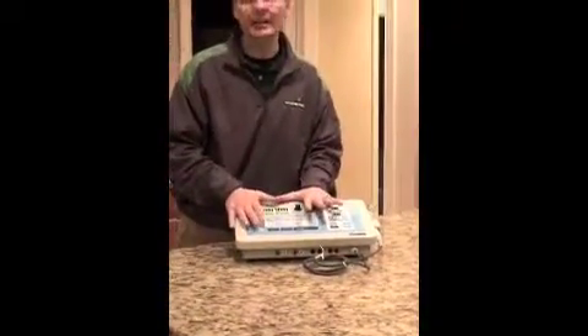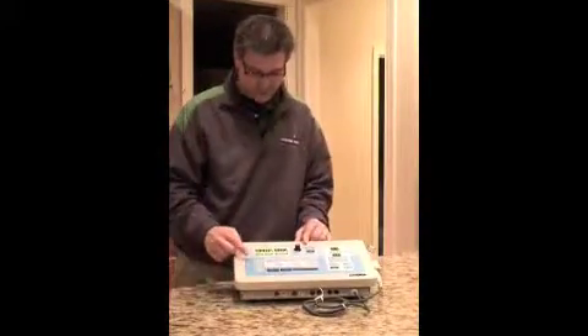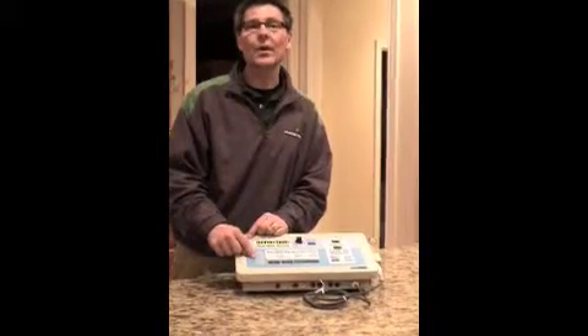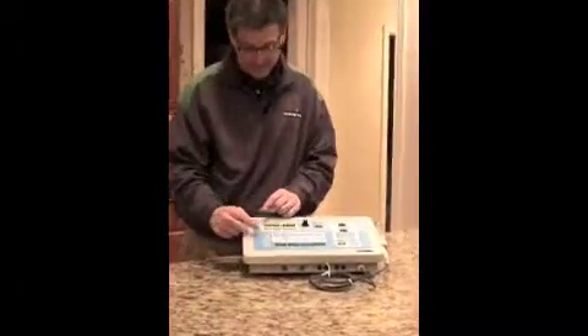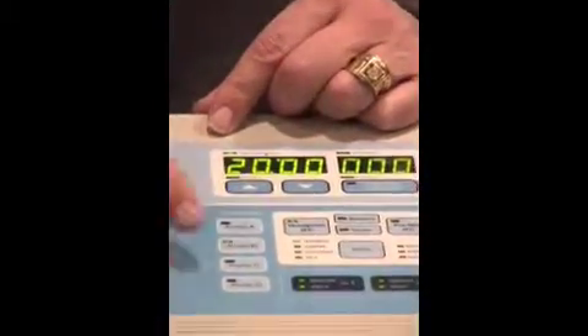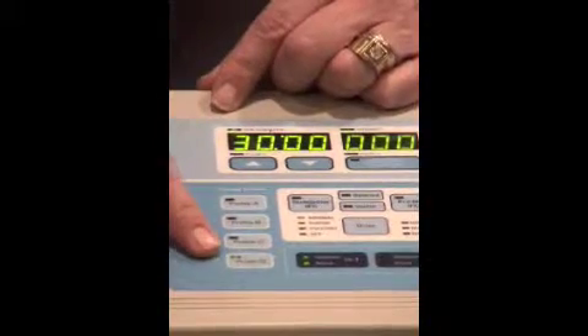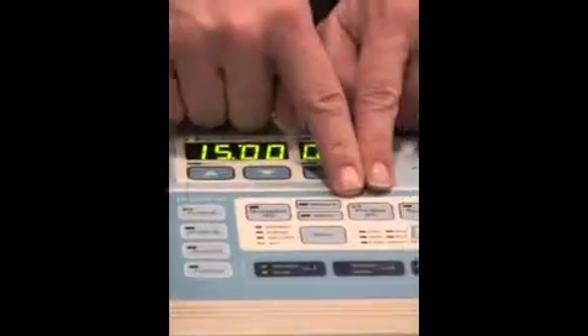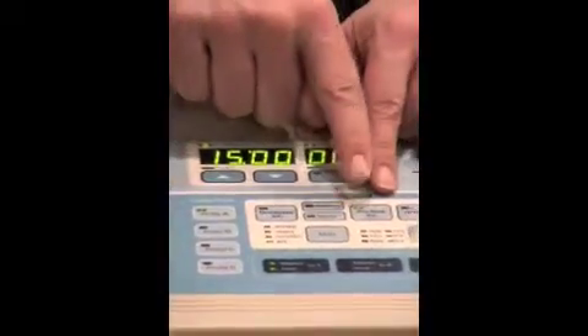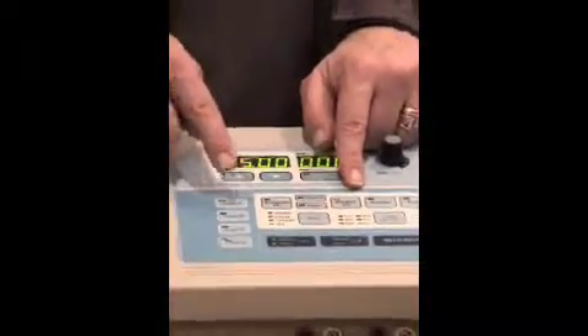When you first approach the machine and are going to do a stim treatment, this is a two-channel unit. We are able to save what we call four profiles, done using these buttons on the side — profile A, profile B, profile C, and profile D. When you press them, they light up. Profile A from the factory is set to pre-modulated interferential, which is the second set of stim buttons moving from left to right.